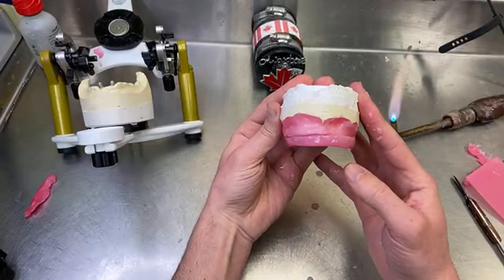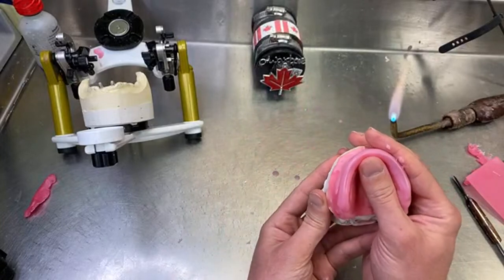There you go. You can call it a bite block.